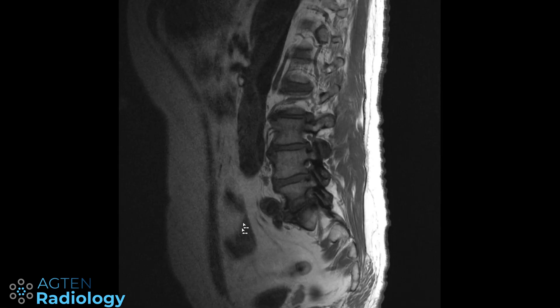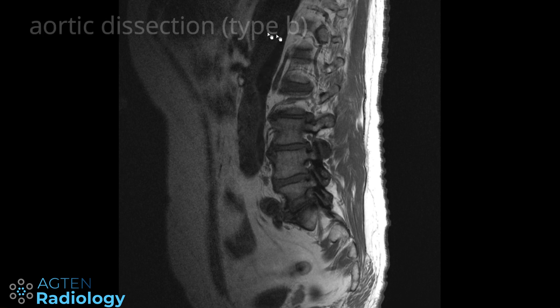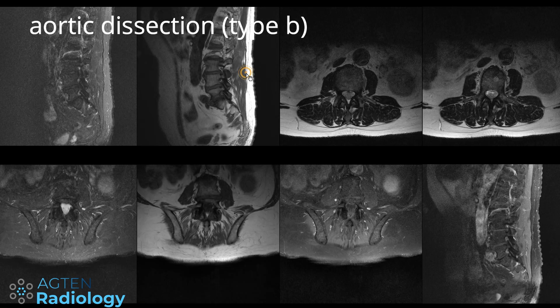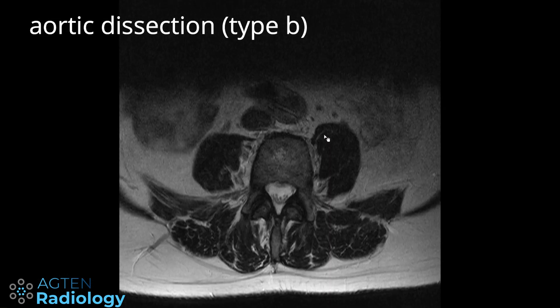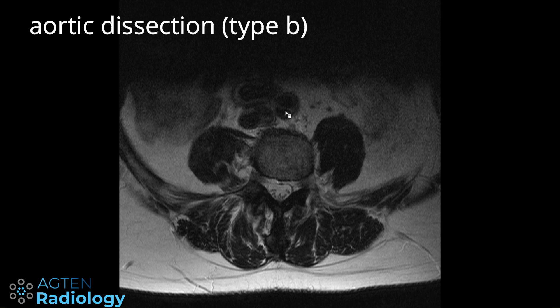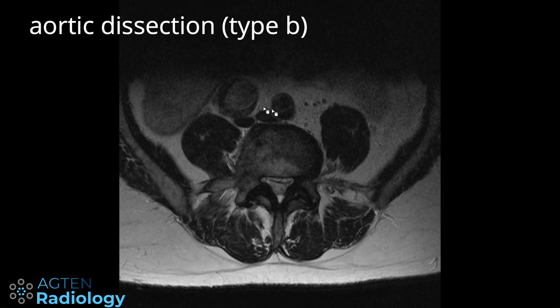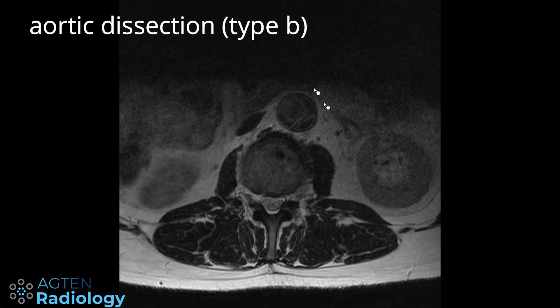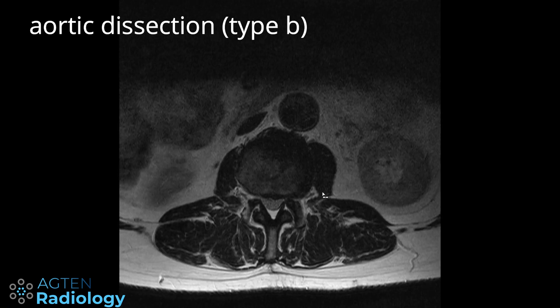Here is a very nice example of a type B aortic dissection with these different compartments of the aorta, also visible on the axial sections where you have the dissection membrane in the aorta and the corresponding changes in the vessel. Always make sure you also have a look at the aorta.